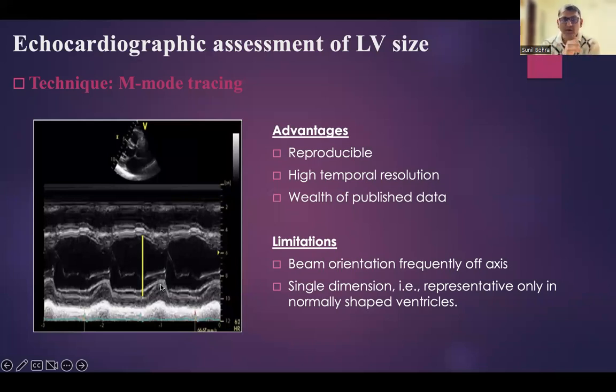So what are the advantages of this technique? The main advantage is that it is reproducible. There is high temporal resolution because of the high frame rate of the M mode. There is a wealth of published data, and there is a lot of correlation between various parameters.